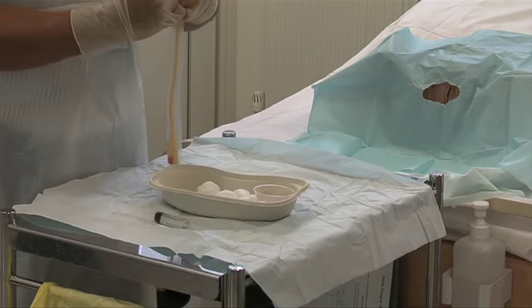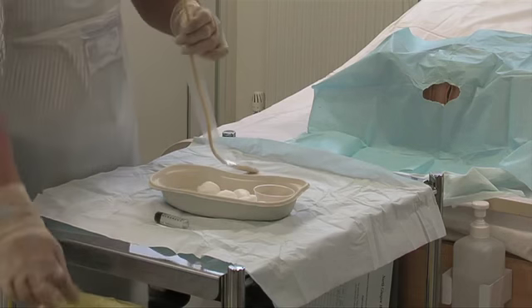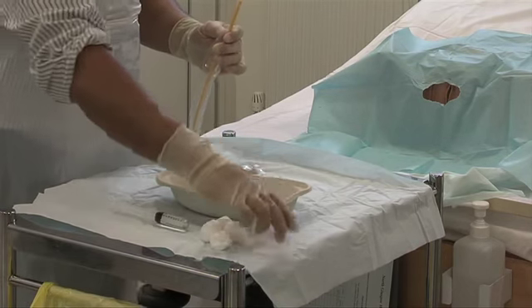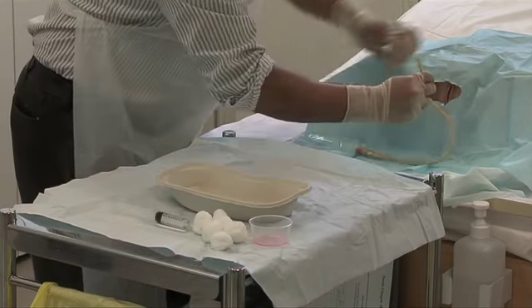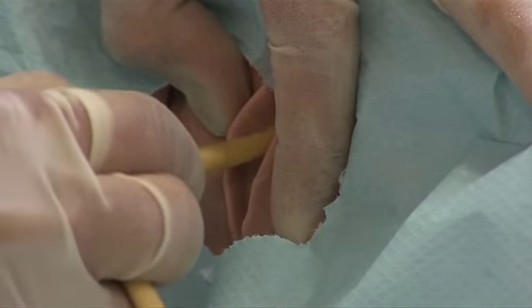Begin by carefully removing the plastic covering from the catheter. Introduce the tip of the catheter into the urethral orifice in an upward and backward direction.